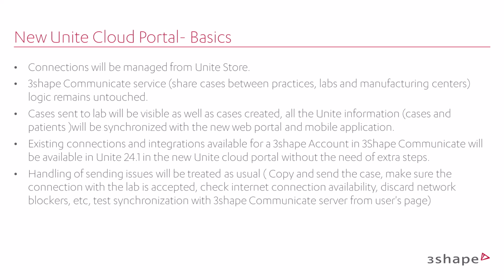Existing connections and integrations available in 3Shape Communicate will seamlessly transition to Unite 24.1 and the new Unite Cloud portal without requiring additional steps. Handling of sending issues will follow standard procedures. Users can copy and send cases, ensure lab connections are accepted, verify internet connection availability, and address any network blockers. Additionally, users can test synchronization with the 3Shape Communicate service from the Users page.